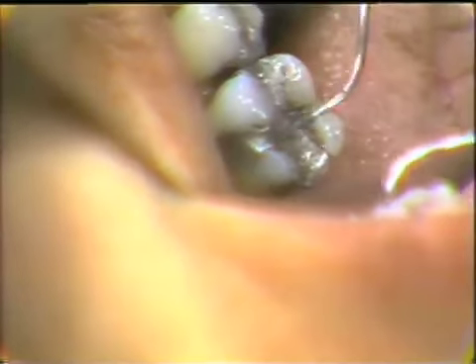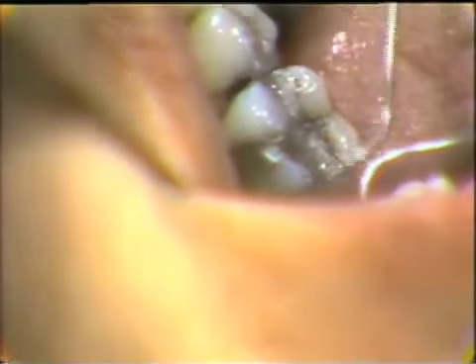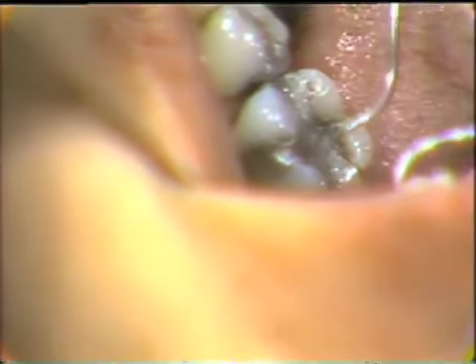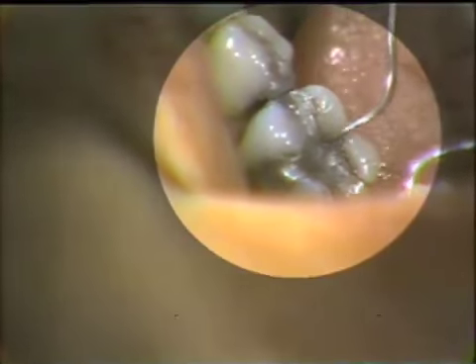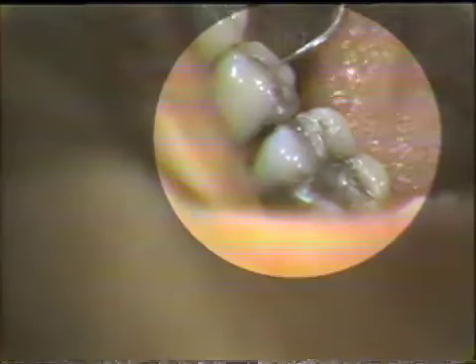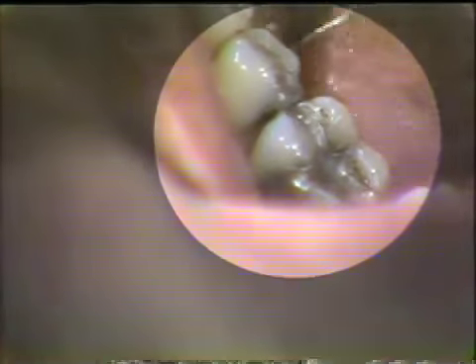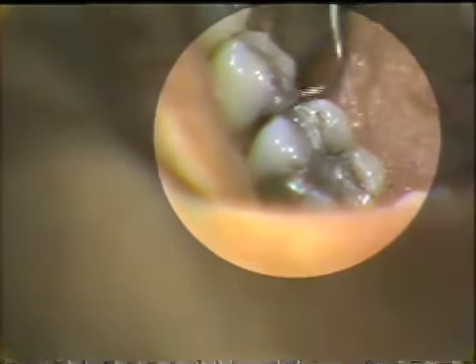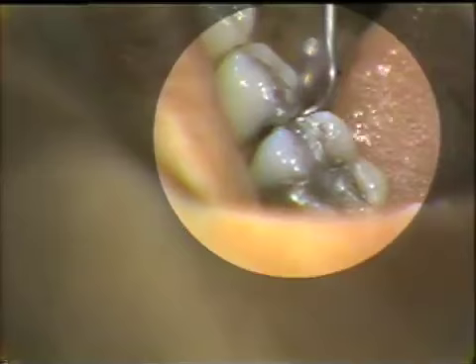The amalgam restoration is cracked, and it has poor margins, so we would make a recording of this. The restoration next to it is also an amalgam restoration on the bicuspid, but it seems to be in fairly good condition, although its margins are not the best.